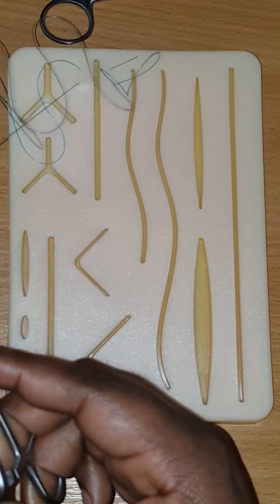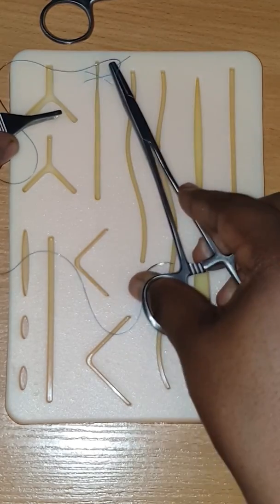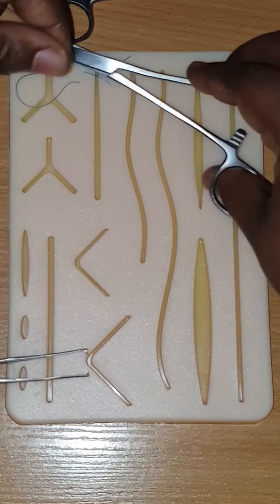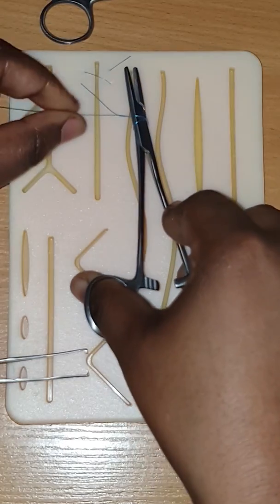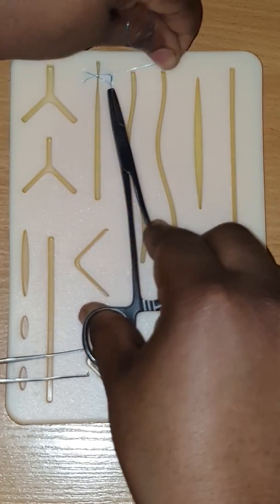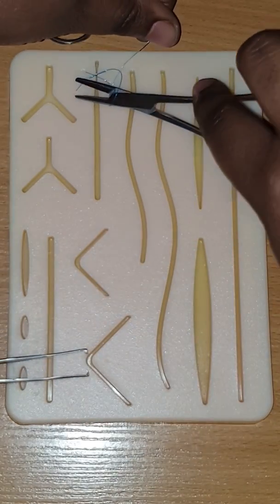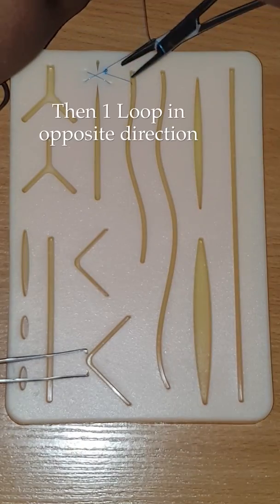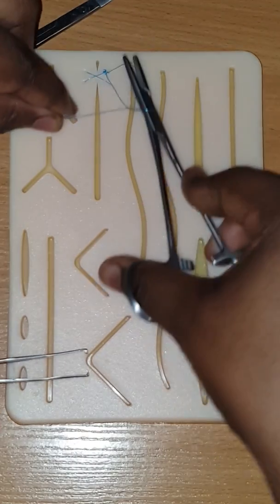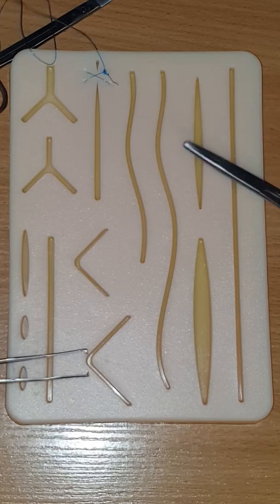This is the fun part. This is the tail, and now we're going to do a surgeon's knot: one, two — around the needle driver, grab that and pull it through. Once around the needle driver again in the opposite direction. And that is the first suture.